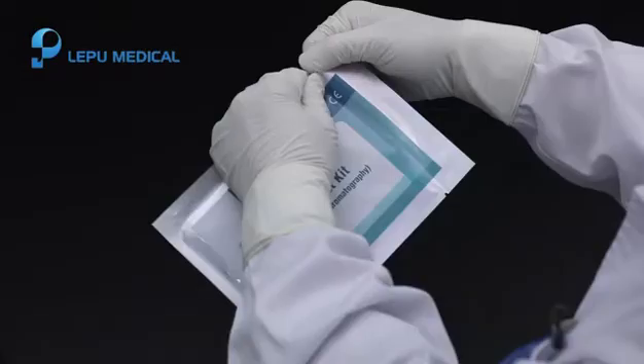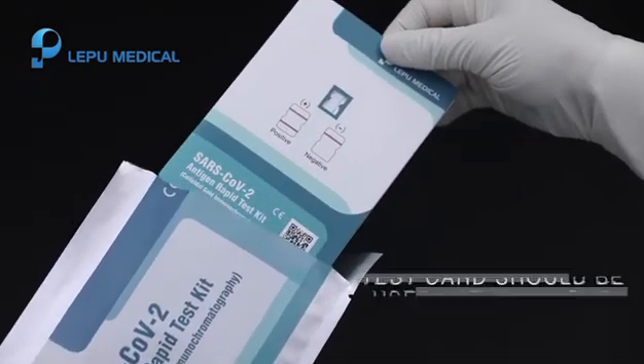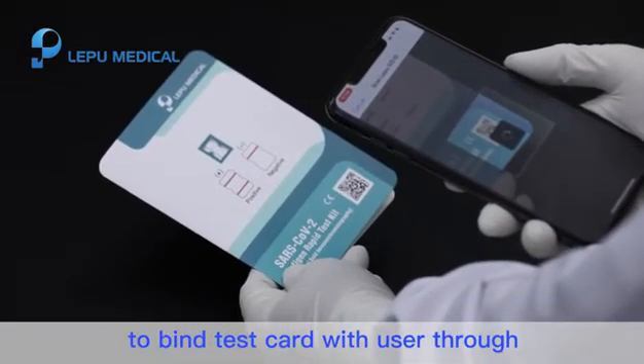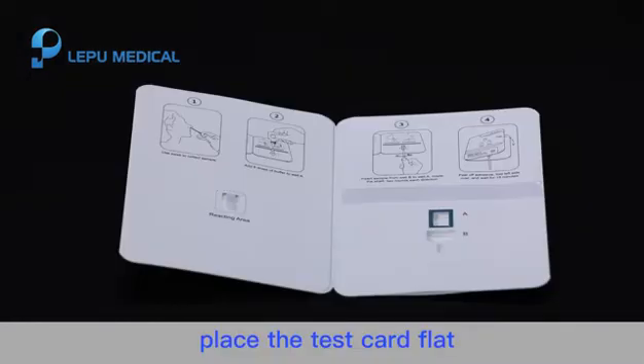Step 2. Tear off the sealed inner package and take out the test card. Scan the QR code on the test card to bind the test card with the user through Le Pu IVD doctor. Place the test card flat on a clean platform.